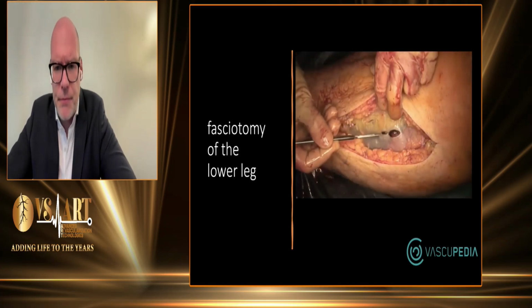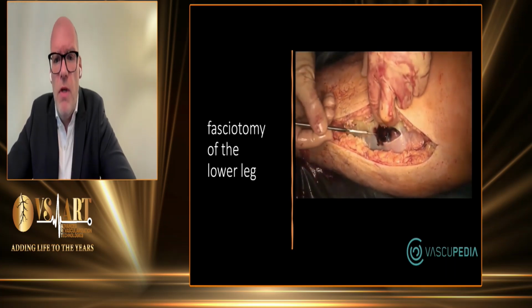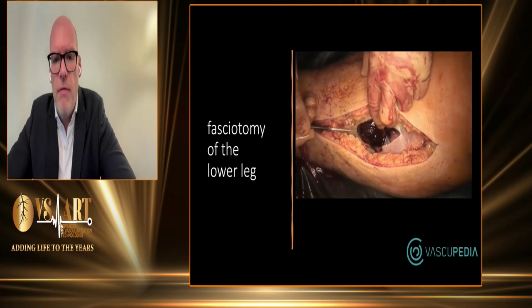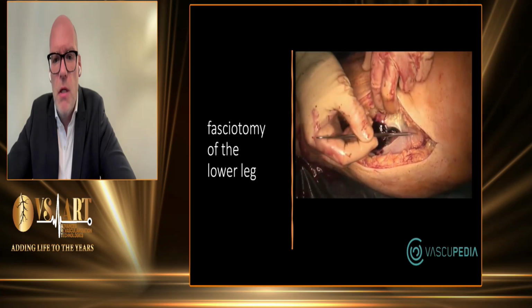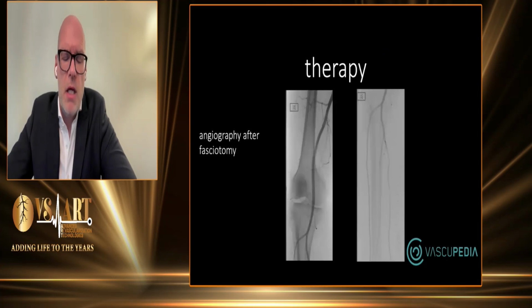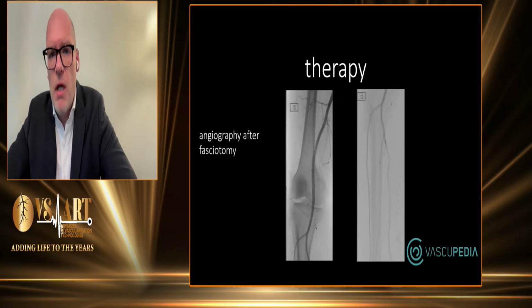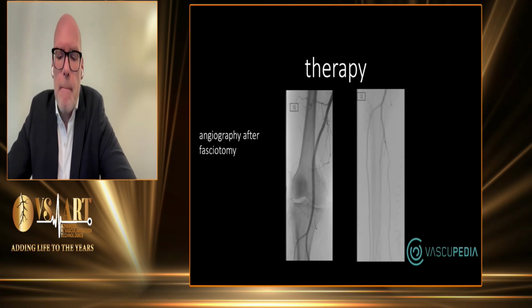And here you see it. The muscle is popping out. It was at that time very vital, so we had some opportunity to save this leg. After that, we did another angiography, and you see that all the vessels come through the leg again.